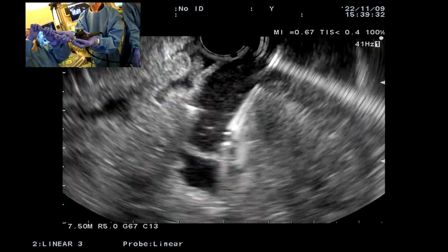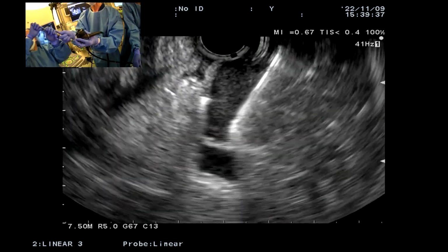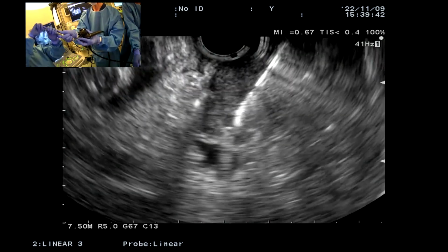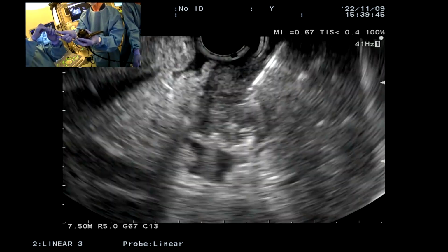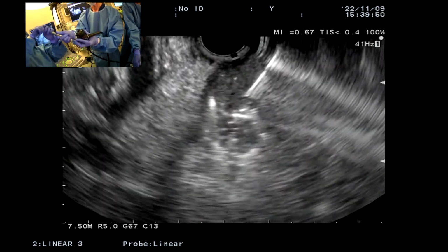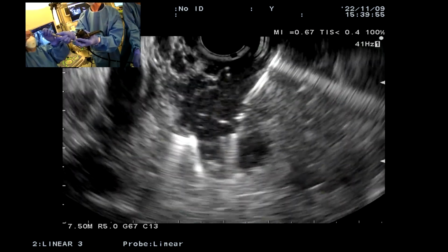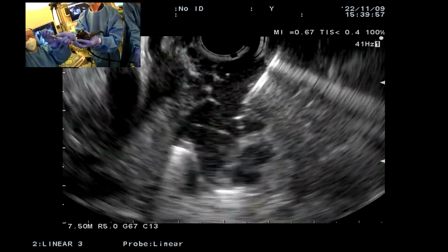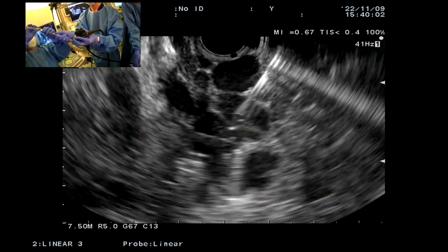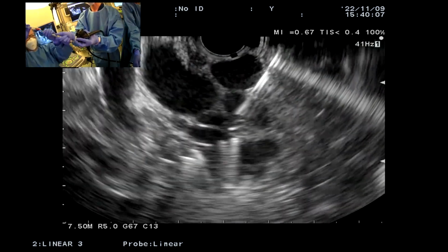All right, so we should have our next coil coming in just a moment. Just adjusting, keep going, yes. Should be pushing out, there it comes. Keep pushing in. Very good. You want a third coil or is that enough? Okay. If you have one more coil, let's put one more coil. Any coil. Let's put one more. These are so big that I really want to pack these up. You can see a little higher up, I'm going to get a coil coming. Please go ahead, yes. This is a case where you really want to pack them in.